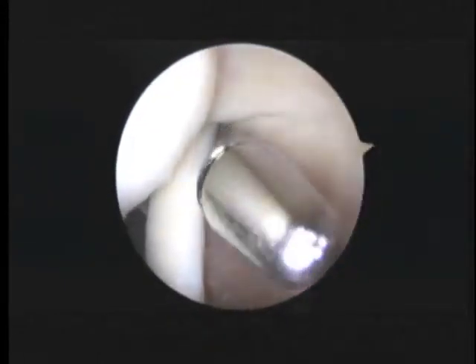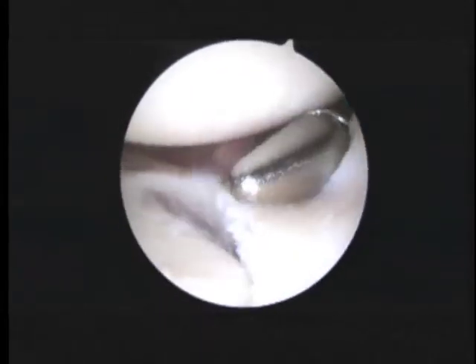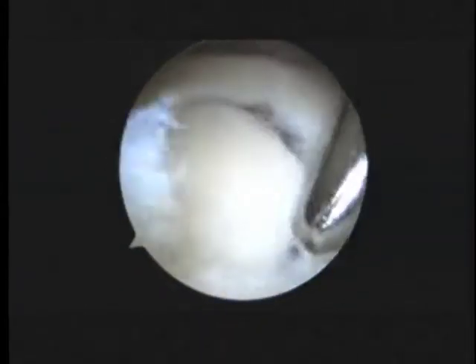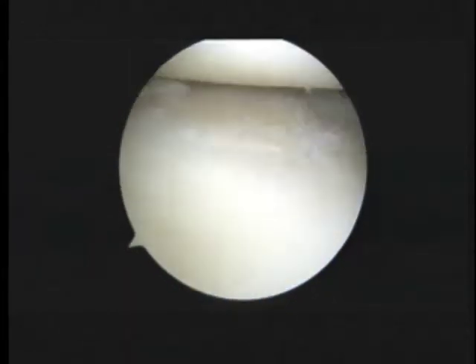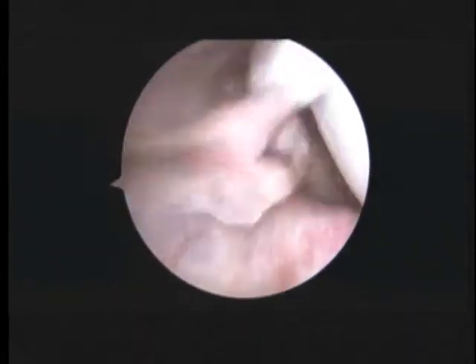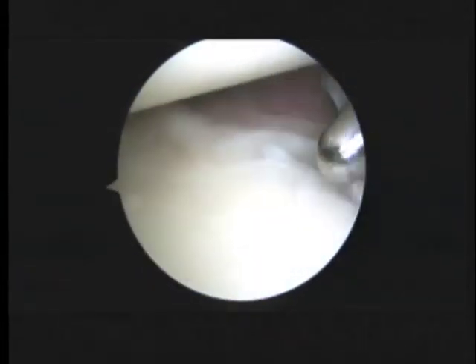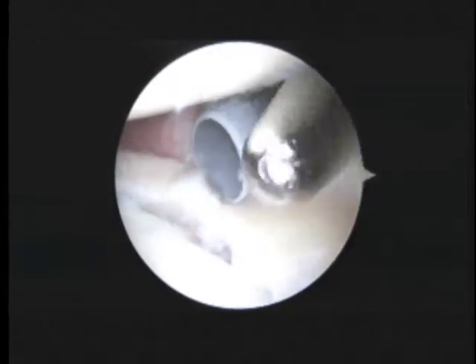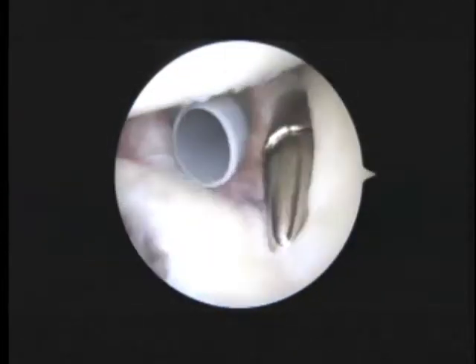Now we're looking up at the rotator cuff, and the cuff looks fine — no signs of any problems with the rotator cuff. Here's where we've been working on the biceps anchor. See the erosion of the bone down below there. I should mention that your shoulder would subluxate towards the back and towards the front. So as we look at these labral tears, we're probably going to have to reattach the labrum and try and give you a bit more of a balanced, stable shoulder.